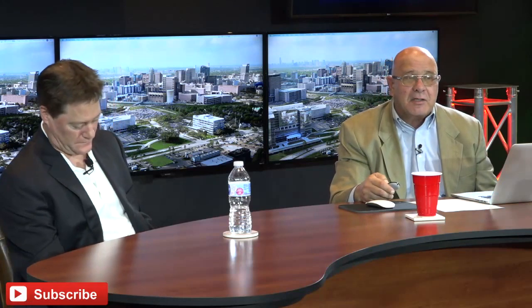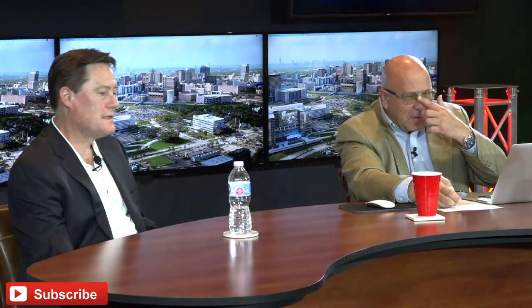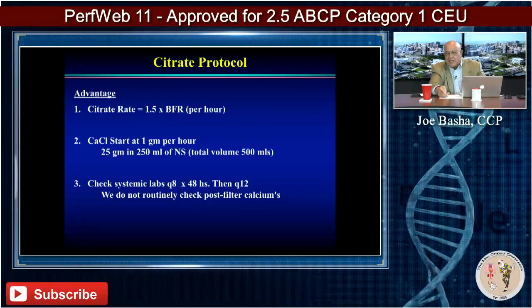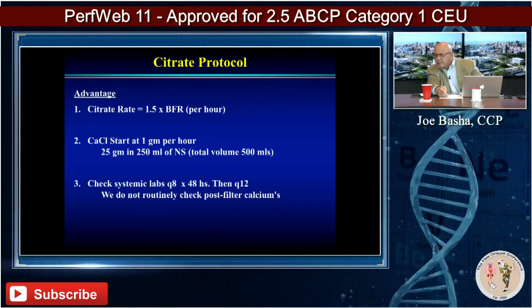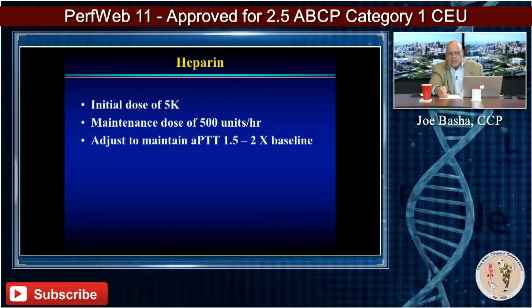because there are patients who are hypersensitive to heparin, of course, and if we could do that and not anticoagulate those patients, we might not have as many bleeding problems as we do, because bleeding on ECMO is a huge problem, right? Yeah. So anyway, here's the formula I was telling you about, and this is how you do it. Make sure that calcium goes into a central line, not into a peripheral line, because if you infiltrate a peripheral line with calcium, we all know what that causes, and it's pretty ugly.